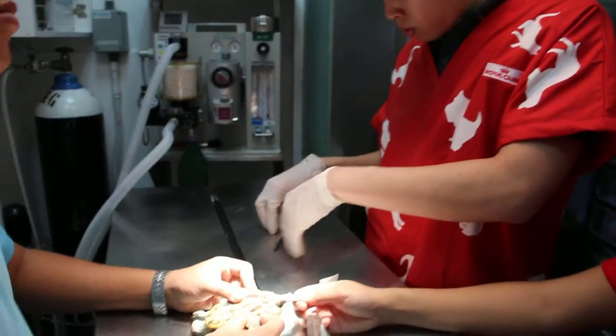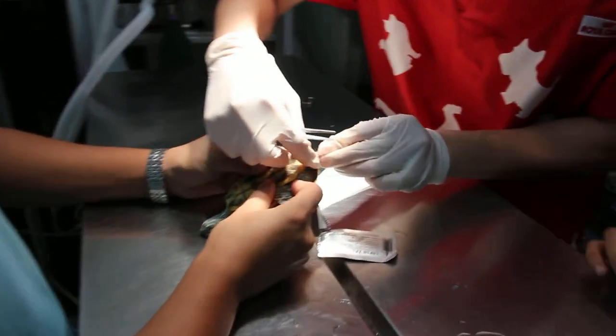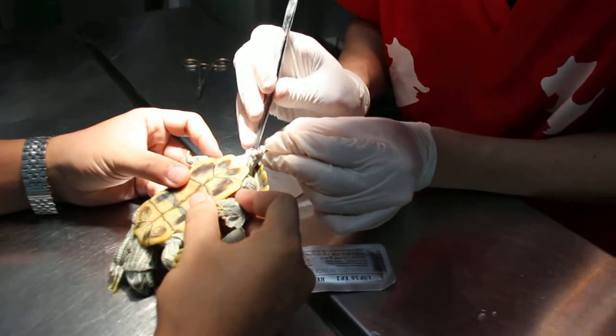Okay, come straight up again. Then put upside down for long enough.